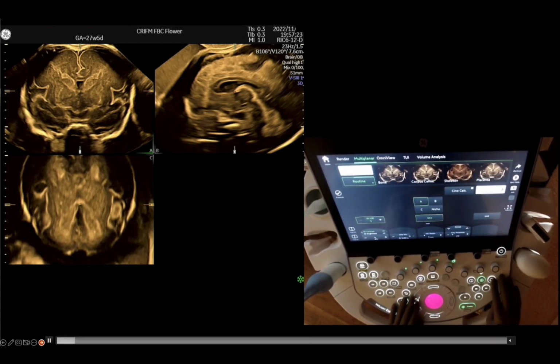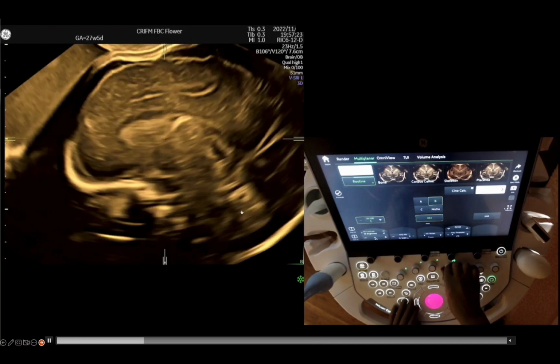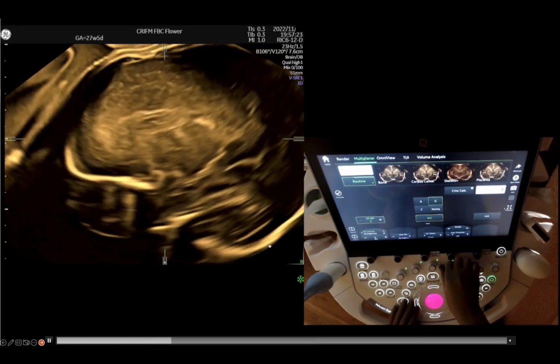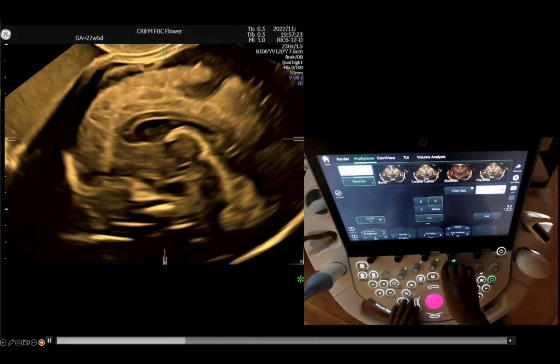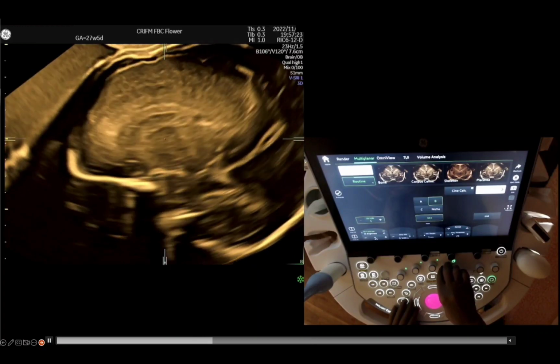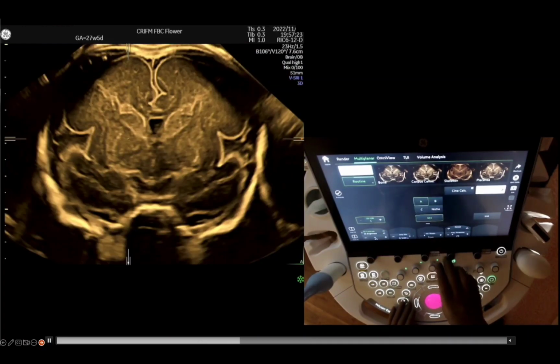Now, once you get 3D acquisition via the anterior fontanelle, you can see the midline structure of the corpus callosum and the cerebellar vermis and the fourth ventricle, and observe the brain structure in detail in continuous parallel sections of the sagittal plane, the left to right sagittal sections.